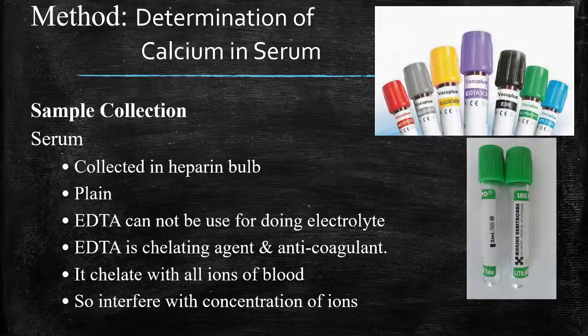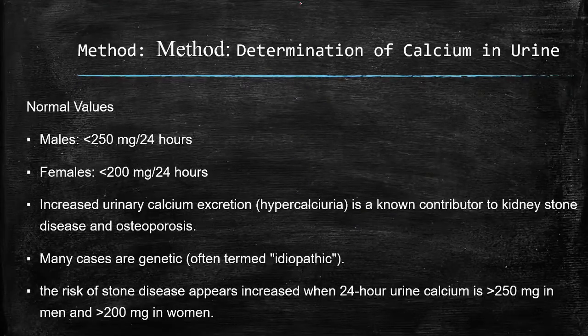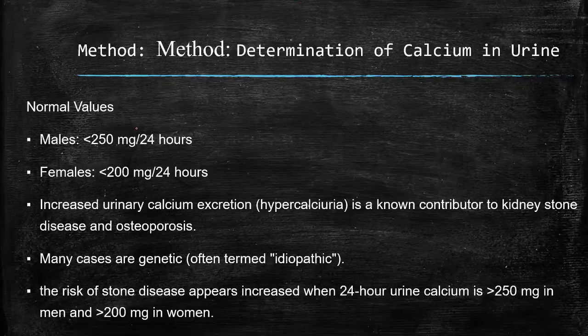Again by ISE technique, that is ion selective electrode technique. Okay, I won't be repeating the method. So the method is the same as the previous one that we discussed in measurement of sodium and potassium. Okay.